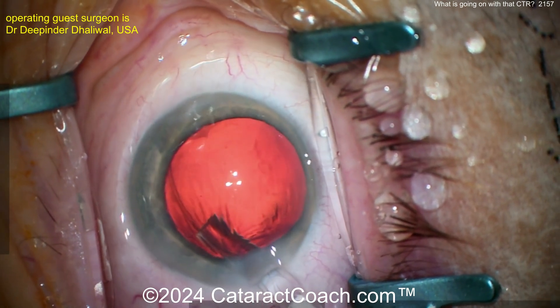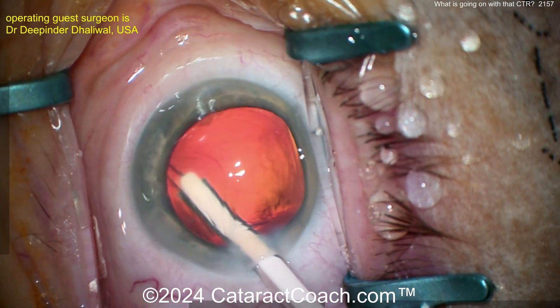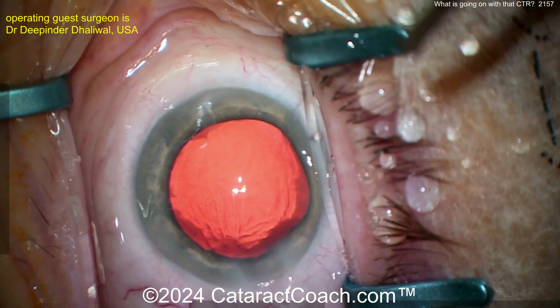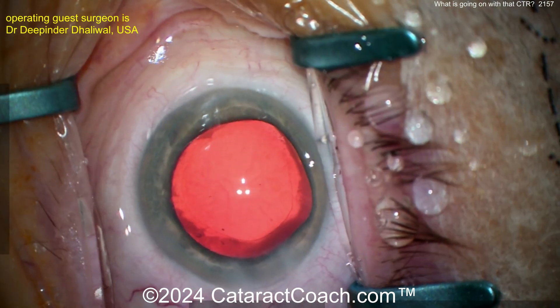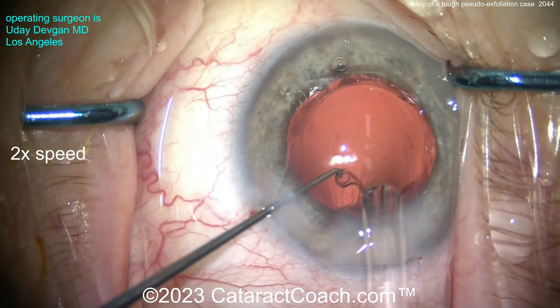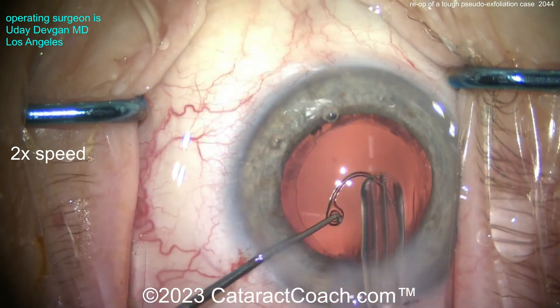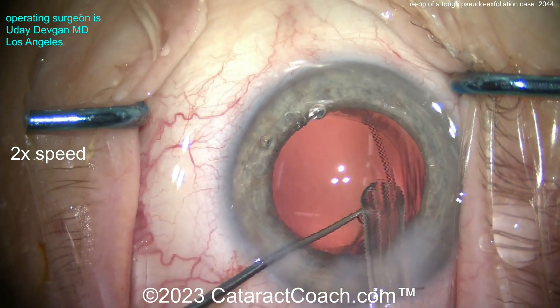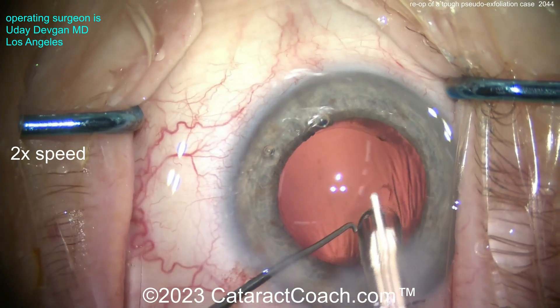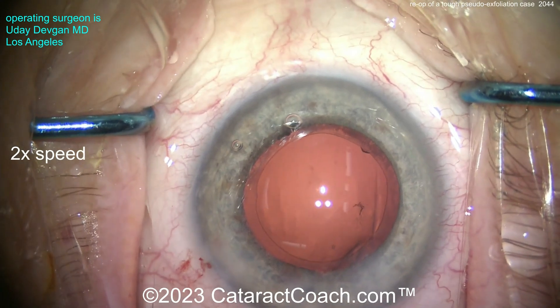You can learn more pearls from her at the Cataract Coach Best of Course at the ASCRS this Saturday — she'll be there giving great surgical pearls. Now let me show you how I like to do a CTR. With an injector, I like to just get that leading eyelet, then inject the other direction so I can guide it right into the capsular bag — boom, boom, easy work.